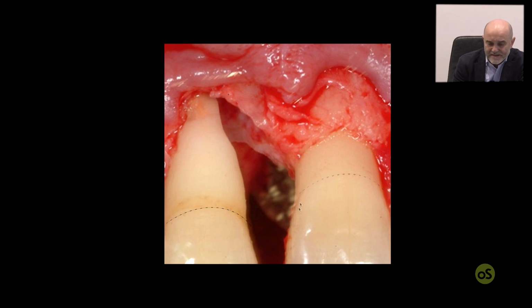But you know that whatever type of papilla preservation you use, the tissue that is closing here has the tendency to collapse inside the defect. That's because the granulation tissue that was filling the intrabony component of the defect is no longer here, and it allowed my papilla to be perfectly in position, as we saw this morning.